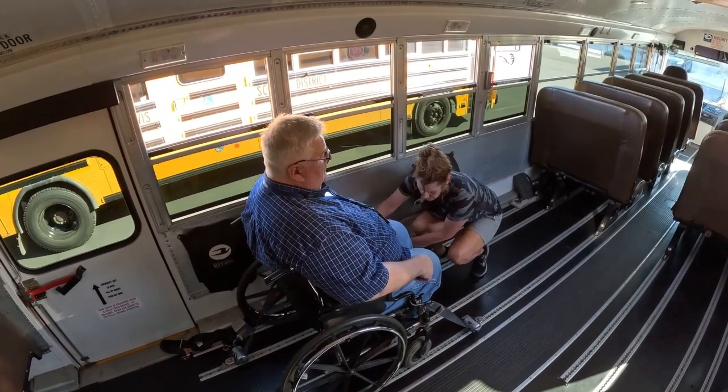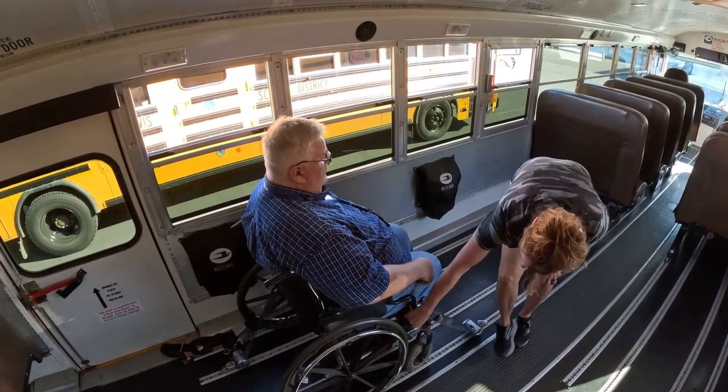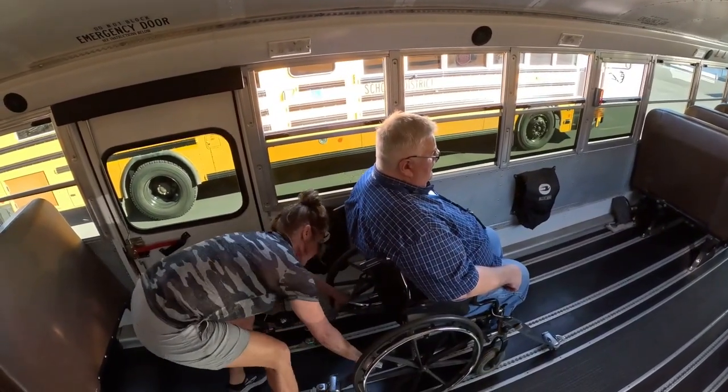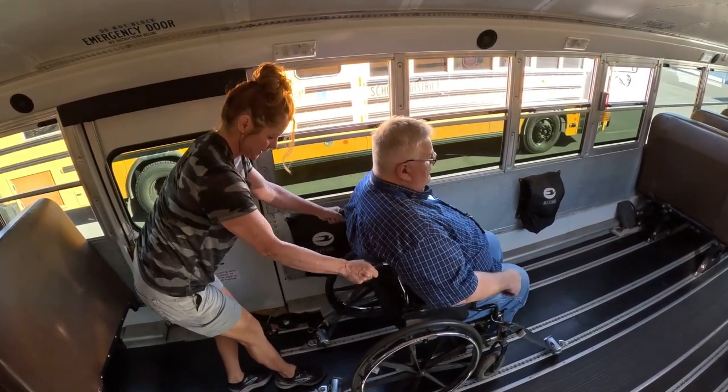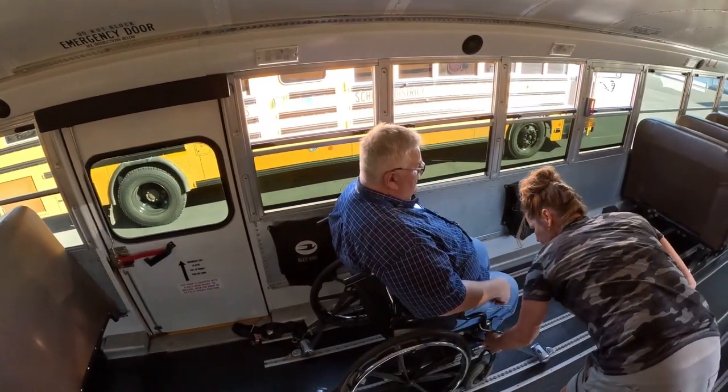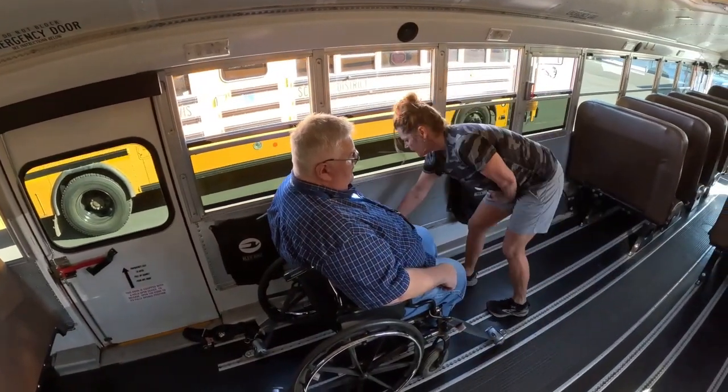We're going to unlock the wheelchair. And then do the wiggle test. Get it locked in. And then put your wheelchair locks back on.